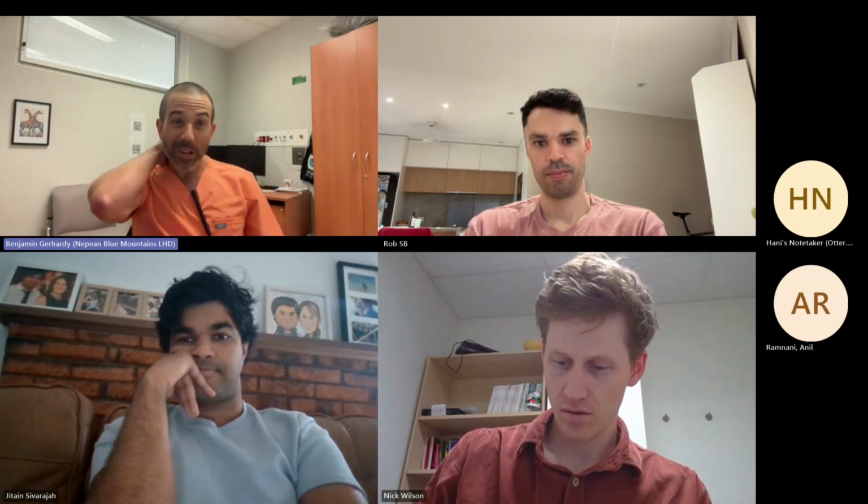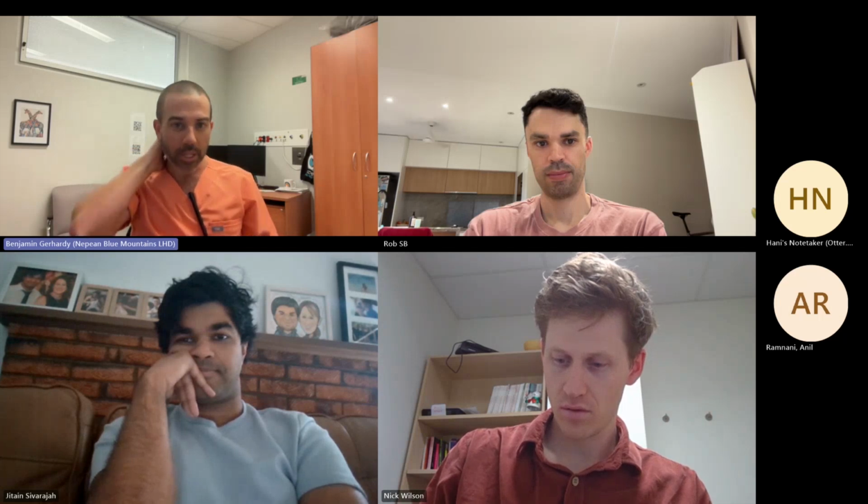So this is a session on lung ultrasound. Sam asked me to present for the first one to be on lung ultrasound, which I'll do. It's pretty straightforward. It covers a bit of the fundamentals of lung ultrasound, really.